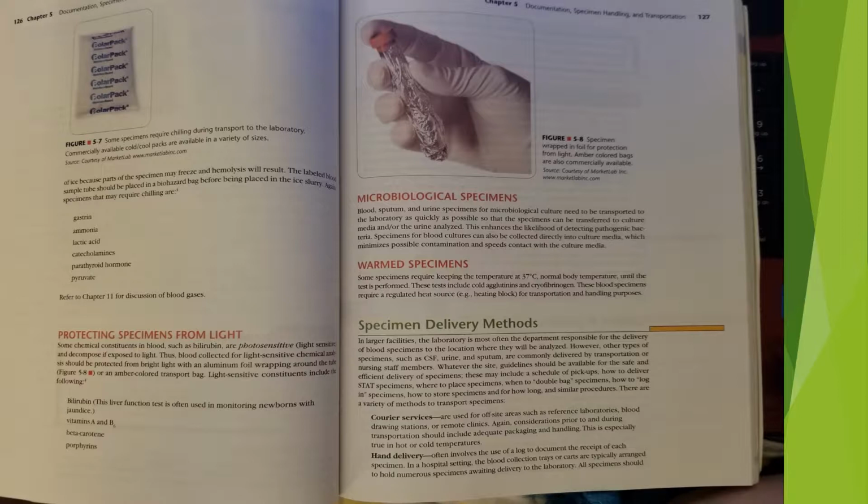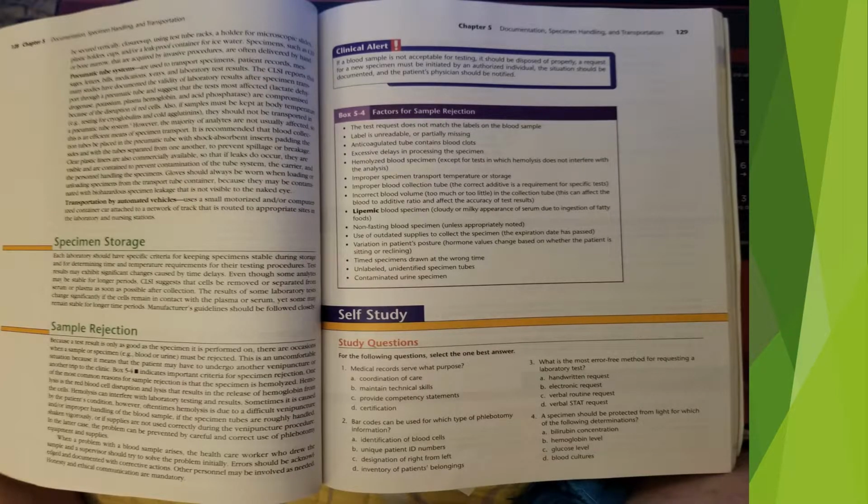Hand delivery. Hand delivery often involves the use of a log to document the receipt of each specimen. In a hospital setting, the blood collection trays or carts are typically arranged to hold numerous specimens awaiting delivery to the laboratory. All specimens should be secured vertically, closures up, using test tube racks, a holder for microscopic slides, plastic holders, cups, and/or a leak-proof container for ice water.